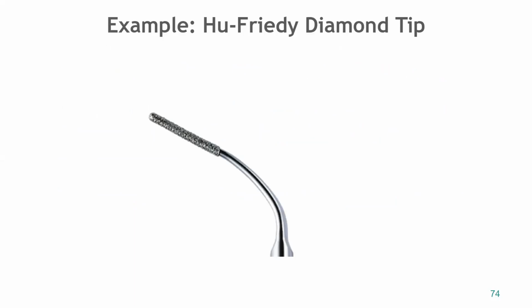If I'm being super honest with you, I don't feel 110% confident with this. I'm really spoiled that I work for a doctor that doesn't create a boatload of overhangs. Even though I did restorative hygiene in school, so I know how to place fillings and how to use interproximal smoothing strips and all that stuff, I still don't feel 100% confident using this diamond tip, just because you can create a lot of root damage with it.